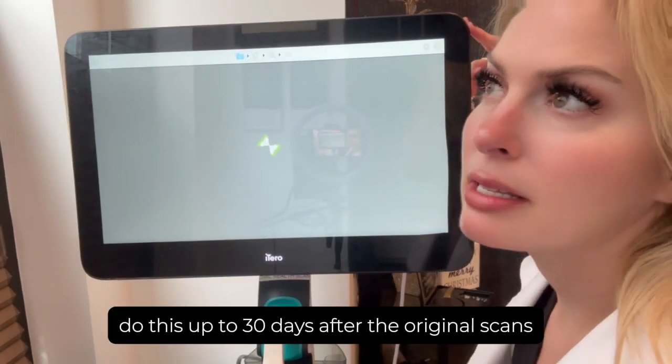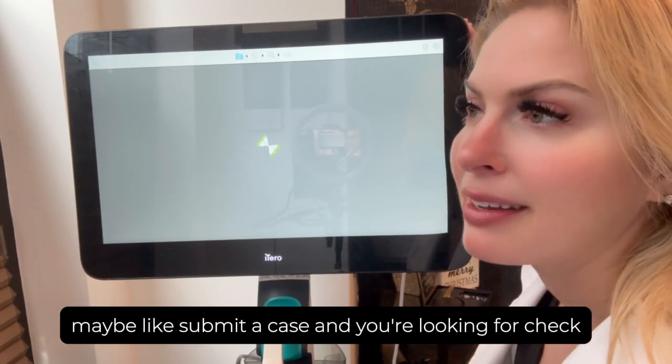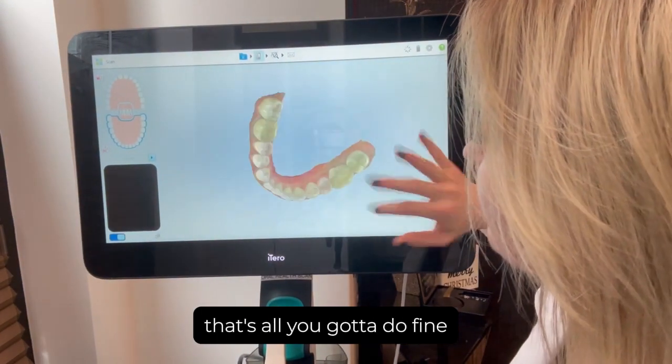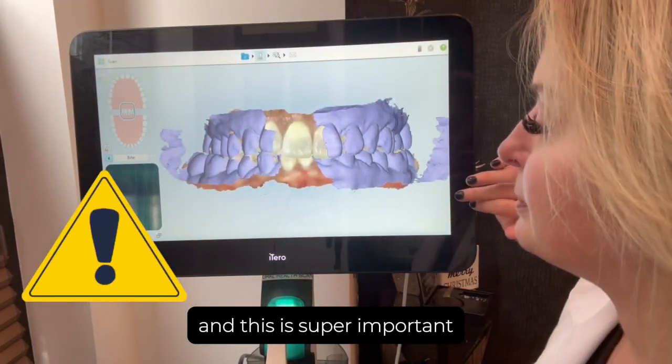You can do this up to 30 days after the original scan. So maybe you submit a case, you're looking at the ClinCheck, and the bite does not look right — that's all you have to do. Go into the bite section, and this is super important.